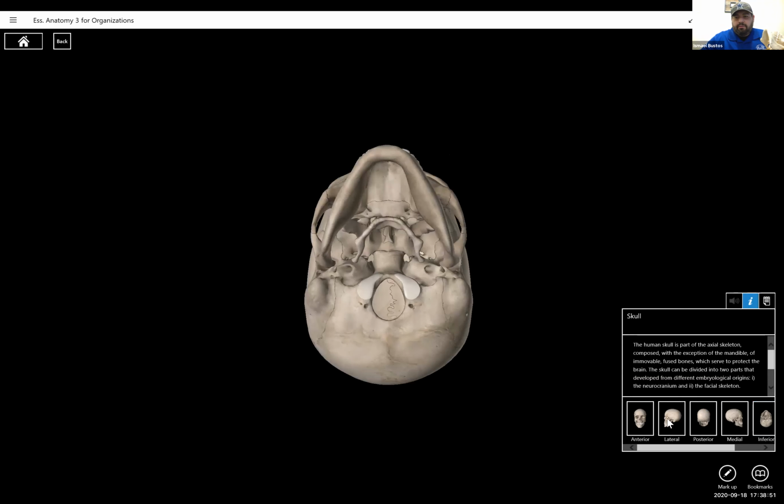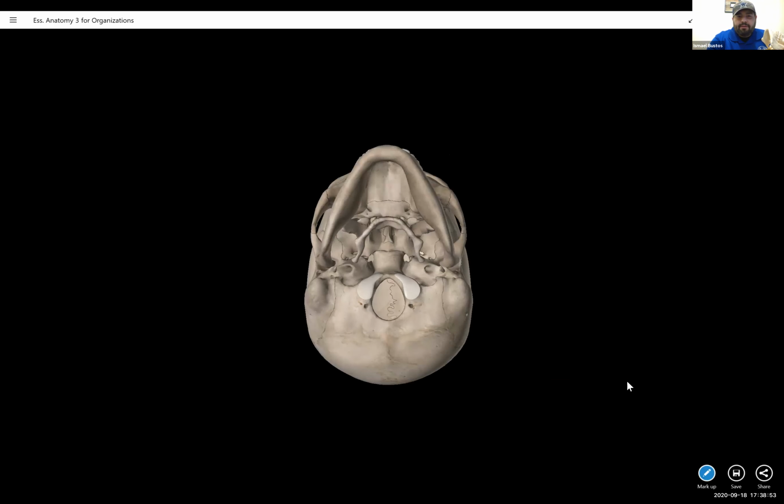We want the CR to enter 1.5 inches below the mandibular symphysis or midway between the gonions. So it should be at a point somewhere around there. And this is what we want to see: the bottom of the skull. We want to make sure there's no basal skull fracture, and that we see the entire skull. We also want to make sure that we have no rotation, no tilt.